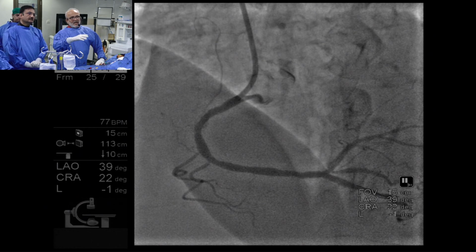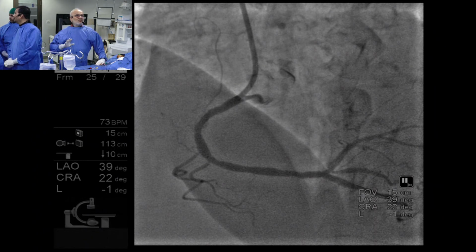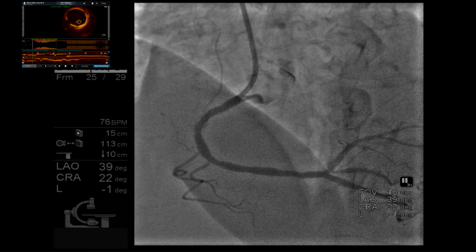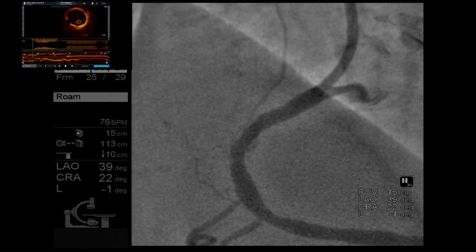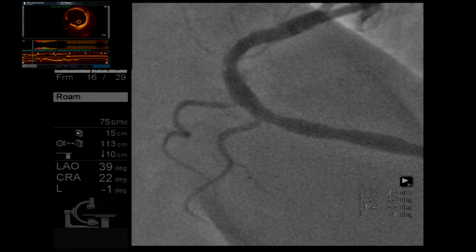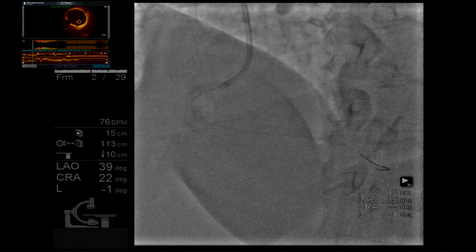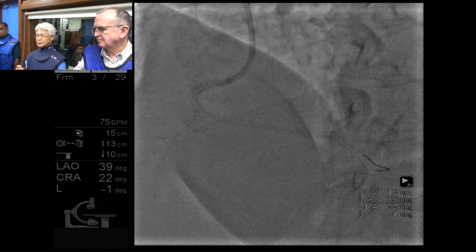We are dilating, we are not going till normal to normal segment. We are trusting here the OCT finding and deciding the length, which is around 12, but at 15 also it is good. Because if I am going proximally, I have to take a 4 millimeter, and there are 3 nodules which are partly broken. That is a matter of concern for me, for perforation in that region. 3 by 15. Well, we were measuring it up here as well. Looks like 15. Can you see the OCT in the auditorium? Yes.